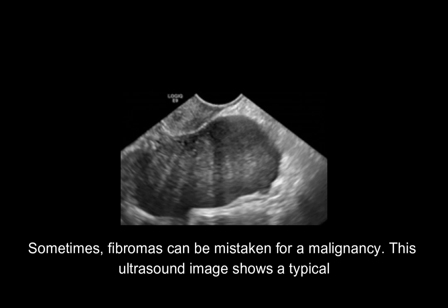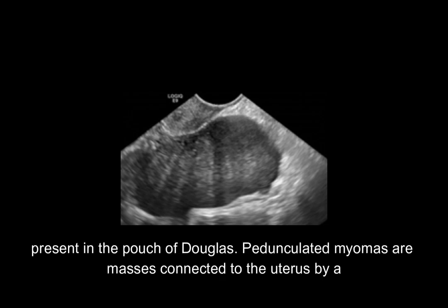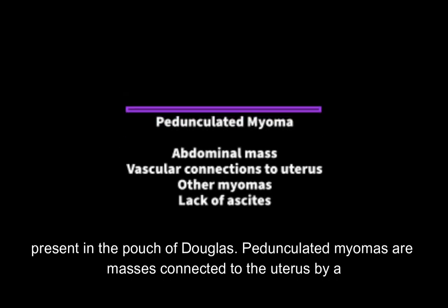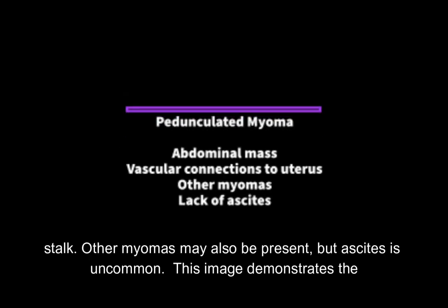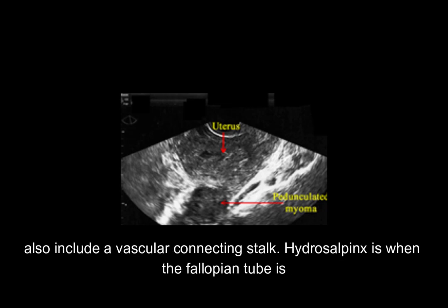This ultrasound image shows a typical ovarian fibroma: a solid tumor with stripe-like attenuated echoes. In addition, fluid may be present in the pouch of Douglas. Pedunculated myomas are masses connected to the uterus by a stalk. Other myomas may also be present, but ascites is uncommon. This image demonstrates the uterus with a pedunculated myoma that is closely adherent to the uterine body. Typical features also include a vascular connecting stalk.